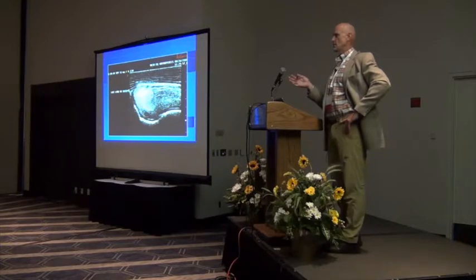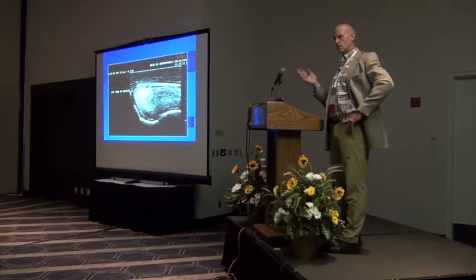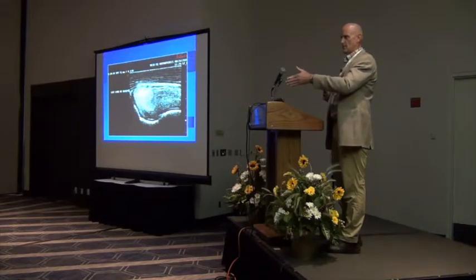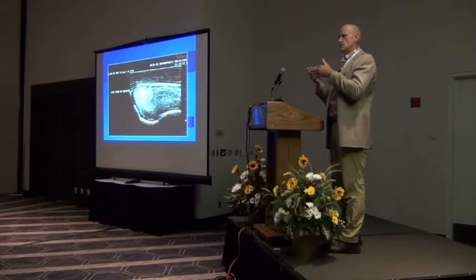And that's where I'm going to ultrasound guide my sticks most of the time. And I don't know that we talk too much about it, but there's a couple of ways to do ultrasound guided sticks. Kurt showed you the most comfortable way to do it, where the needle crosses or is right in line with the beam. You can do a transverse view where you see the needle cross the beam.